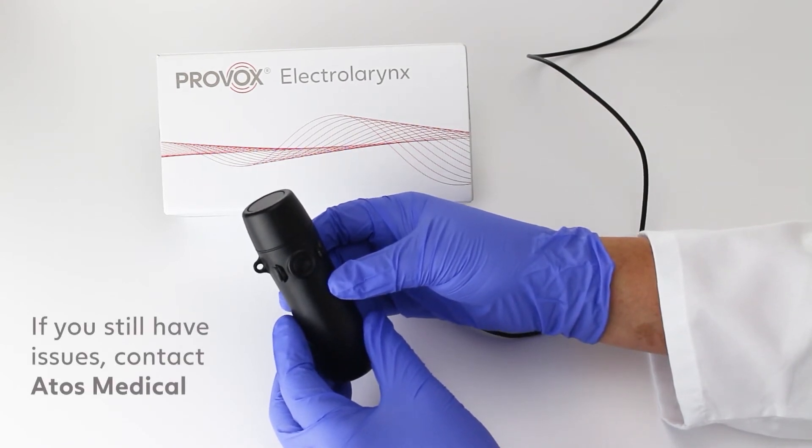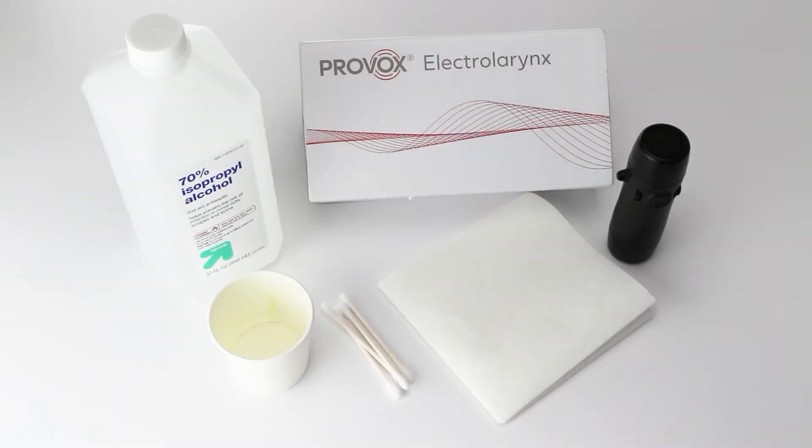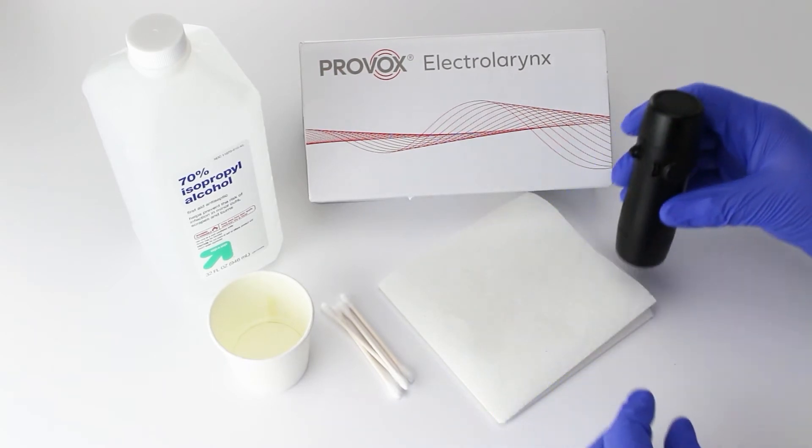If you're still experiencing charging issues, please contact ATOS Medical. If you are experiencing issues where the device continues to vibrate after letting go of the power button, you may have a sticking button.